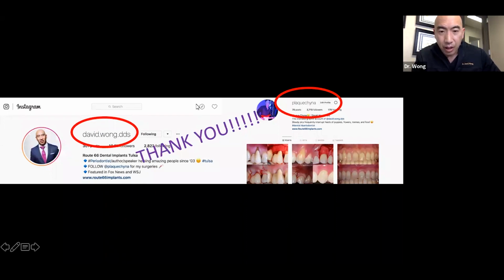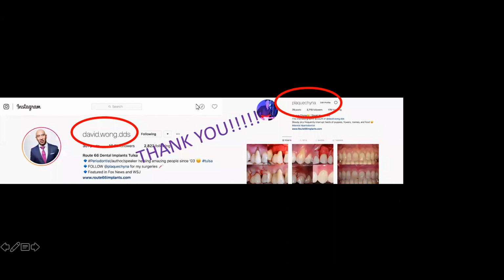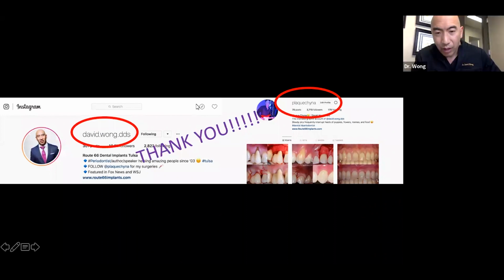Ossix Plus. Ossix comes in a grafting material as well as a membrane. You can't use the Ossix Plus membrane for the ice cream cone because it tears too easily. As soon as you touch it or try to manipulate it or even push on it, you'll rip a hole in it. As far as the grafting material goes, I'm assuming we're talking about Ossix bone. Good grafting material, probably just a little unnecessary for the expense of it. But it is very practical. It's just that the cube is so small, you can't do a whole lot with it unless you buy the bigger cube, which is going to cost you a little bit more money that you don't really need.